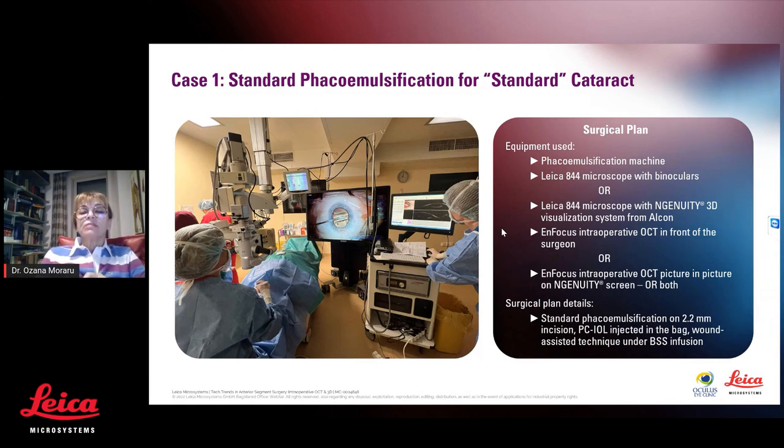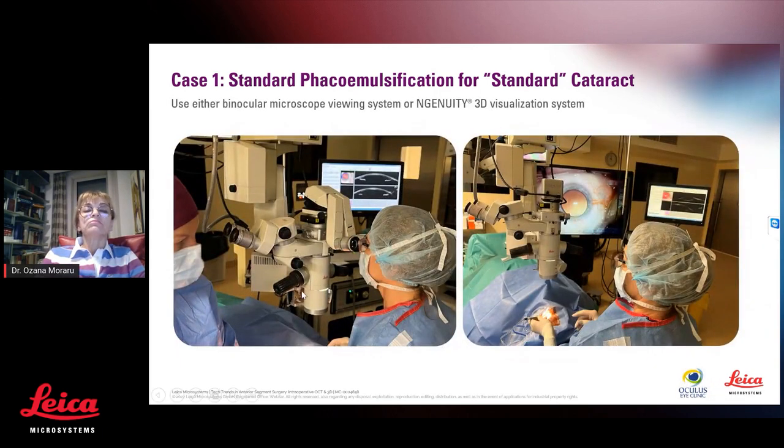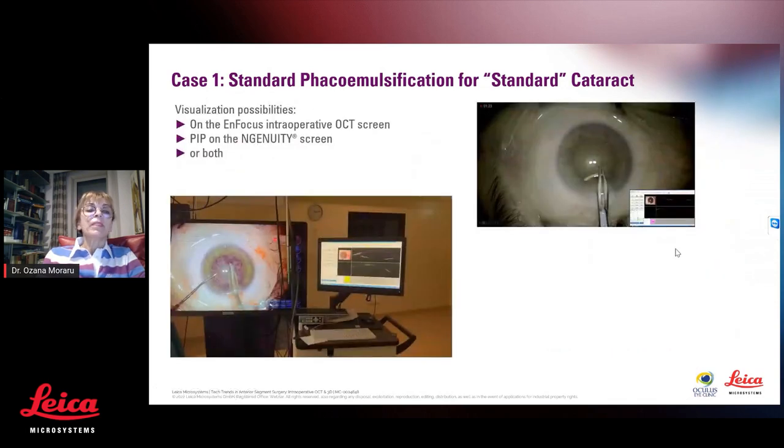And I am prepared to perform a standard phacoemulsification surgery. Here I'm using the binoculars of the microscope, and here I'm using the Ingenuity system.